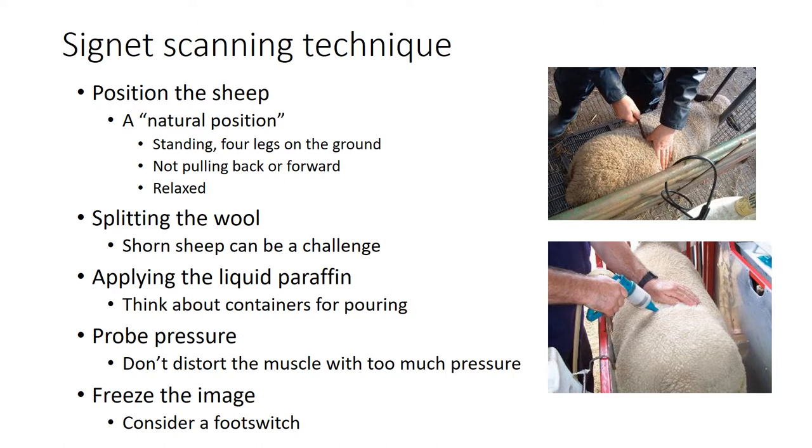The important thing with the Signet scanning technique is that the animal is in a relaxed, natural position - not leaping about, pulling or straining, which can distort the shape of the muscle - standing with all four legs on the ground. You'll split the wool using a blunt pencil-type shape, then apply a little liquid paraffin using various containers. Be careful not to put too much pressure from the probe onto the muscle as you try to get a good image, as that will distort the muscle shape. Some ultrasound scanners also come with a foot switch so you can freeze the image without taking your hands off the sheep - because you really need three hands for this job on some occasions.